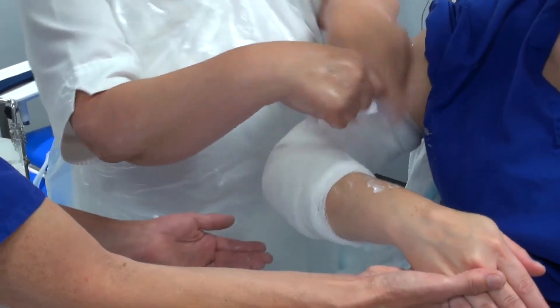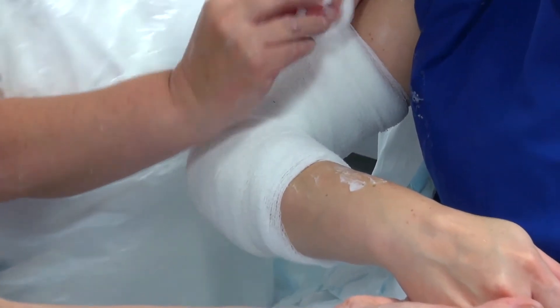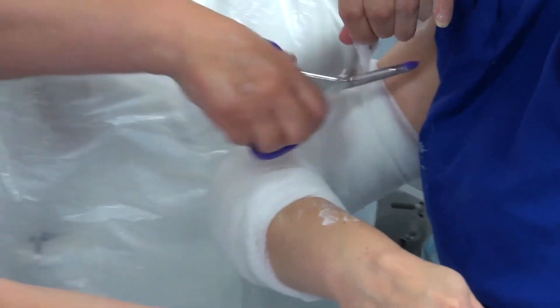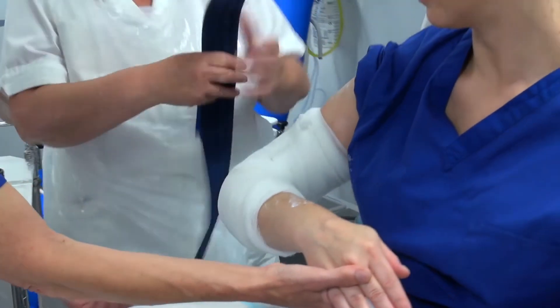Is that comfortable? Yeah, that looks lovely.